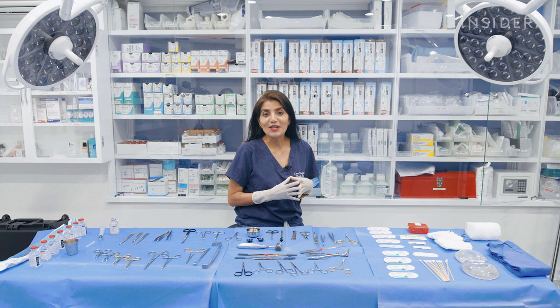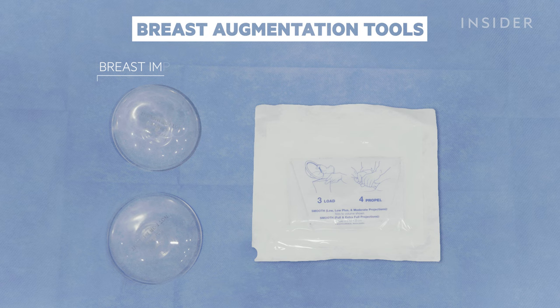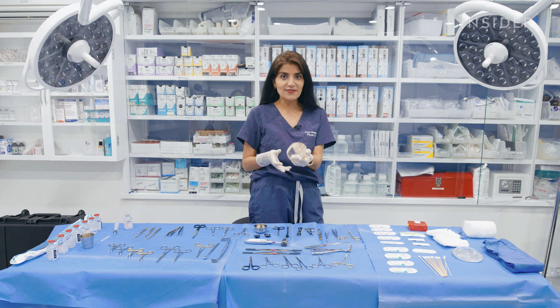One of the most commonly performed plastic surgery procedures in the United States and in my practice is breast augmentation. And this is what a breast implant looks like. So this is a sample of a highly cohesive silicone gel breast implant. It's very squishy and feels very nice and natural.